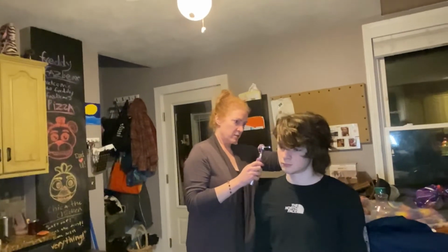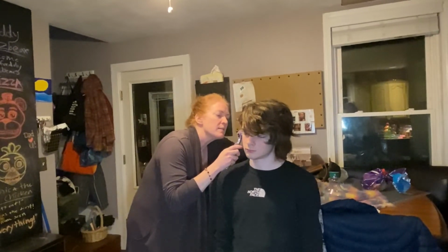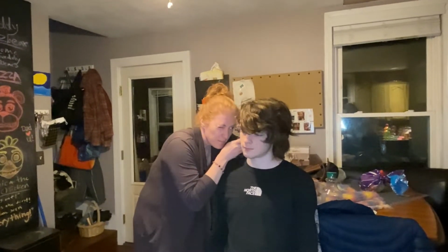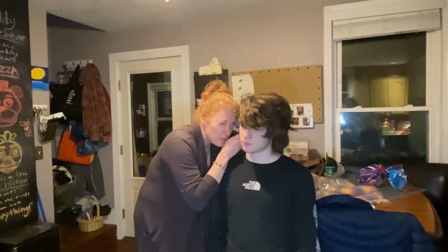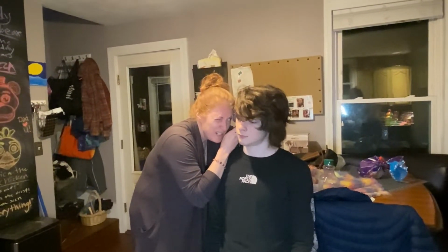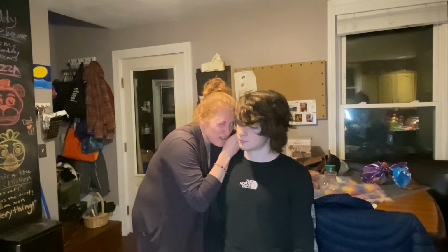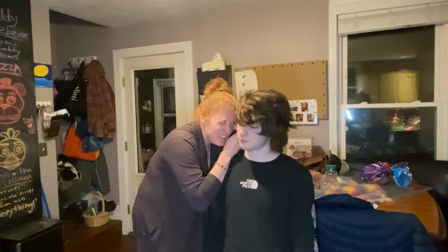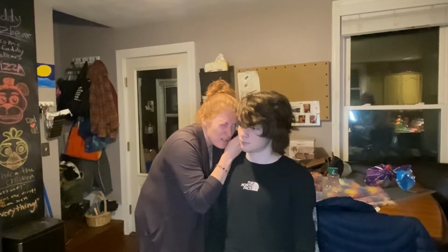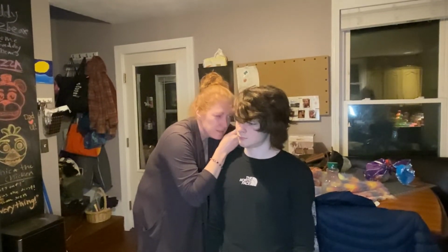While I'm looking here, everything looks okay in the outer areas. All right, we're going to look inside. I see some earwax within the canal. Great. I can now visualize the tympanic membrane. Are you comfortable? Yep. It is a pearly gray. Cone of light is an appropriate area. There does not appear to be any bulging. Malleus is within normal. No erythema or edema noted in the canal.